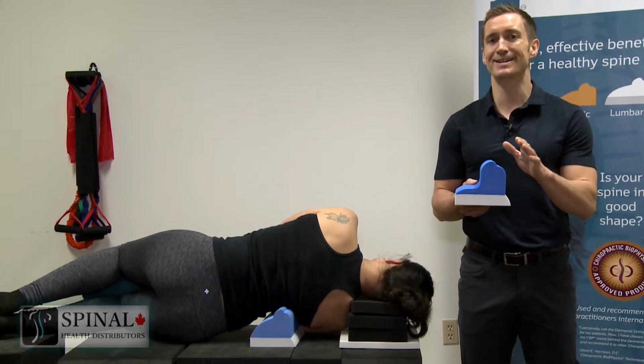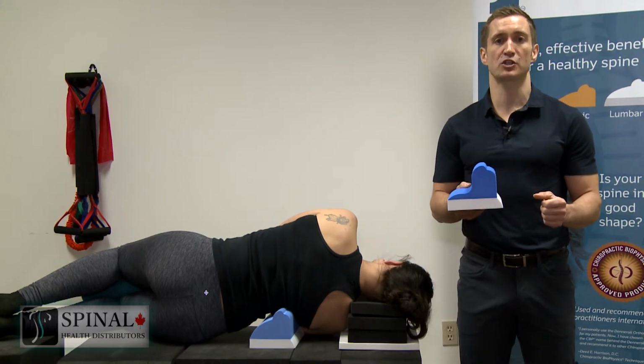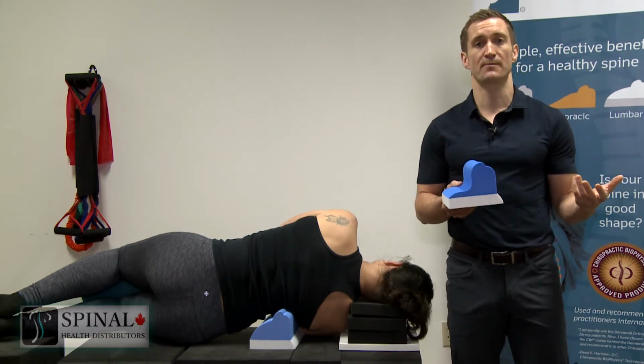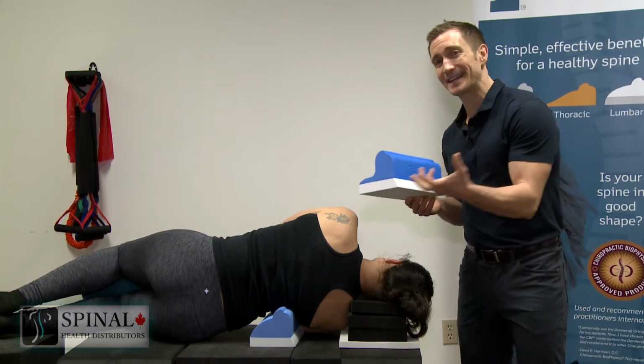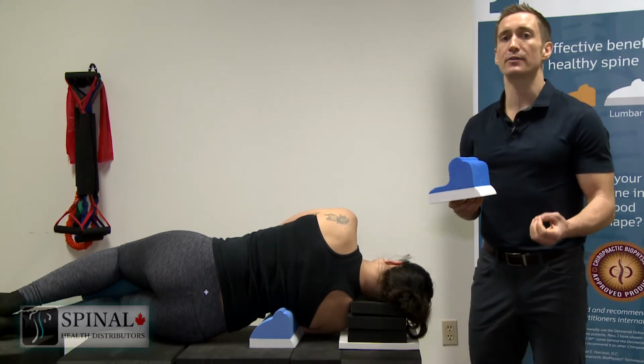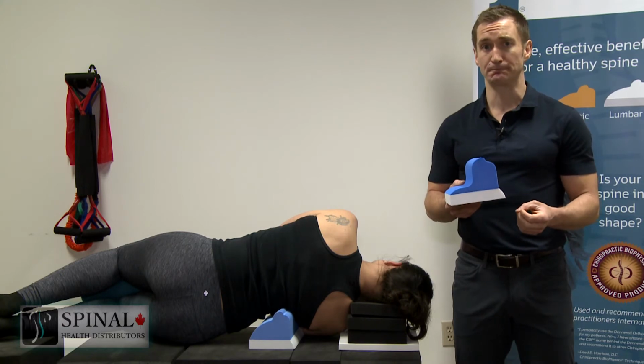If you're uncertain exactly where to position the Scoliroll or if the Scoliroll is appropriate for a patient, we can simply do a stress x-ray. So we would set up the patient just like this in front of our x-ray machine, and we could take an x-ray of the patient lying on the unit to see exactly what we're getting.